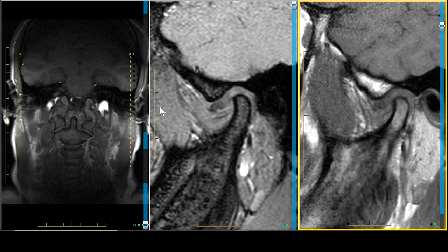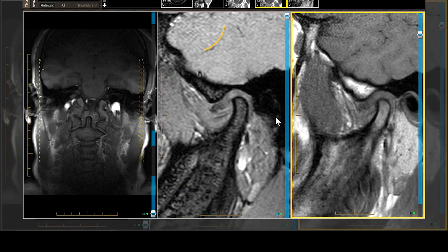Let's take this 22-year-old man with Tourette's syndrome, who has unrestricted facial movements, and look at his gradient echo on the left and his T1 anatomic image on the far right. The meniscus should have three components: an anterior band, an intermediate zone, and a flared posterior band. Where is the flared posterior band?